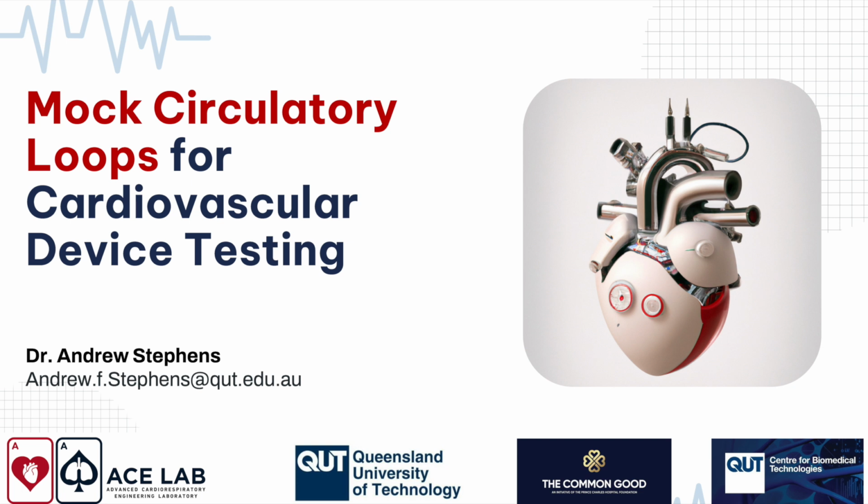The number one important thing to consider is how you are going to connect your device to your mock loop, and make sure that you can connect it in an easy way that doesn't leak and doesn't require a lot of tools to put together, especially if you're going to have to bring your mock loop to the competition. So design the rest of your mock loop around your total artificial heart. That might mean putting some of the connections in the middle and building the mock loop around it. It might mean a number of other design considerations. So do that as your first step in building a mock loop.